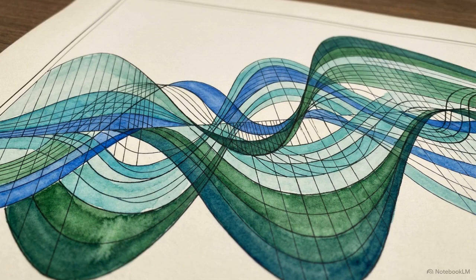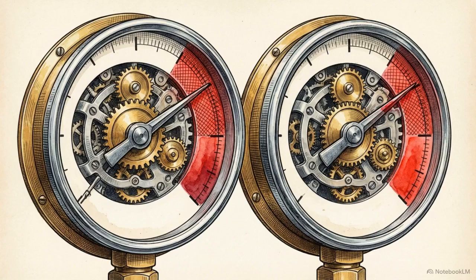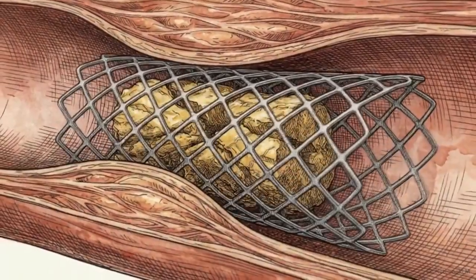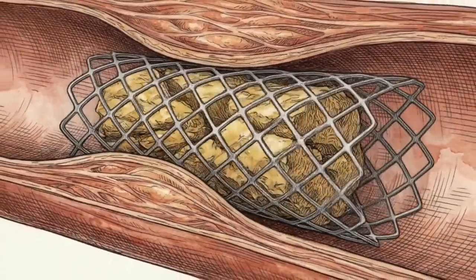To determine if the angioplasty failed, we measure the fluid dynamics. If there is a residual physical stenosis greater than 30%, combined with an arterial pressure gradient over 10 or a venous gradient over 5, the intervention has failed. Only when these pressure gradients are met do we introduce a stent. The metal physically blocks elastic recoil, holding the space the balloon created.